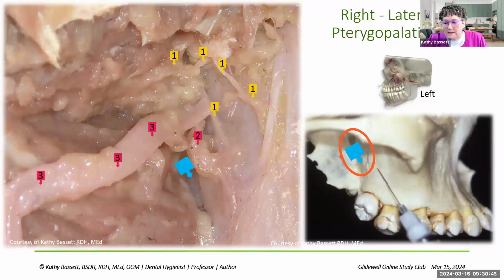And on the bony specimen, again, here's the space right up in there. And notice how high it is. It really is up at the level and behind the zygomatic arch. So when most of us are giving anesthesia for those molars, we'll be addressing potential infiltrations along that group of teeth. If you approach it as a true PSA nerve block, then your target is generally at least above the maxillary tuberosity. But most of the time, it doesn't really go much further up behind.